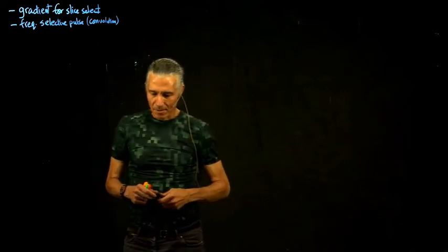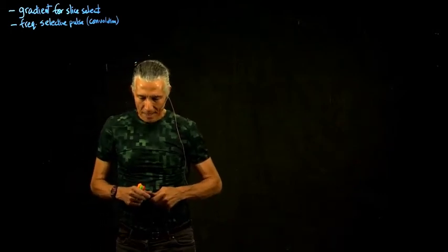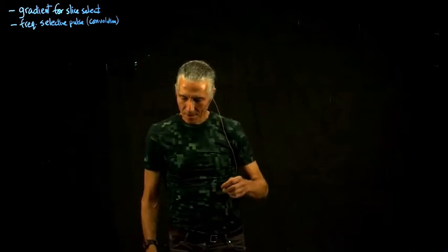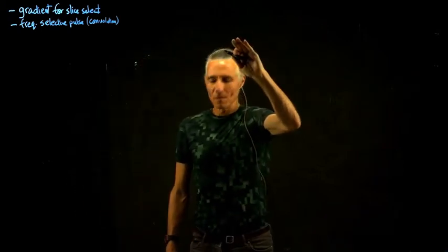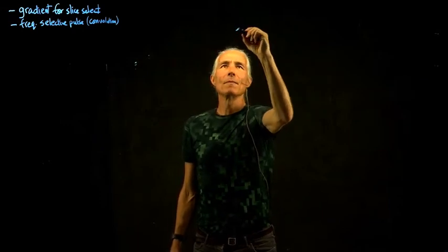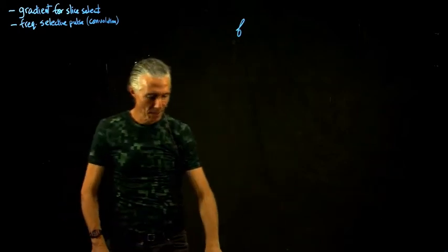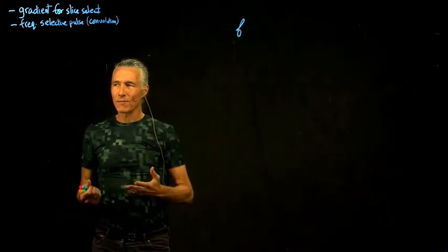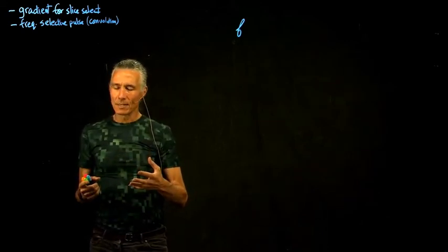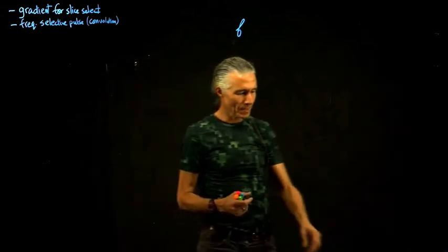So what is convolution? Let's see, how many do I have here? Yeah. So we'll put our convolution over here. Convolution is another function. It's a little bit like the Fourier transform. The first intuition about convolution that's worthwhile is that it's just like a Photoshop filter. Say you want to blur an image. When you blur an image, you're applying a convolution to the image.